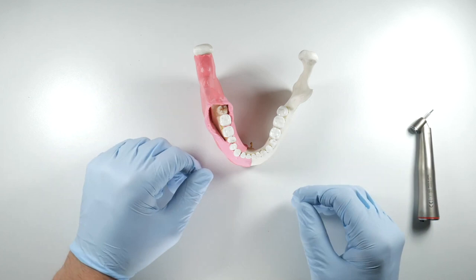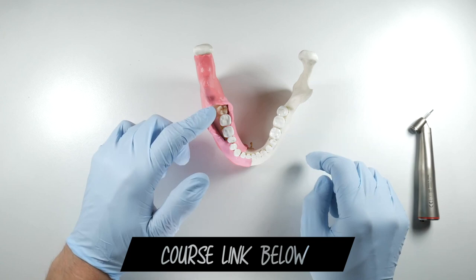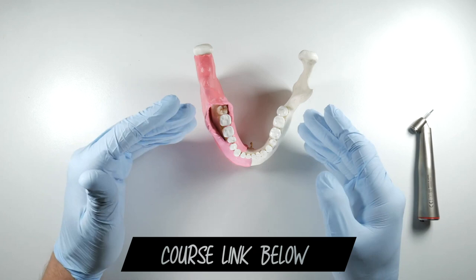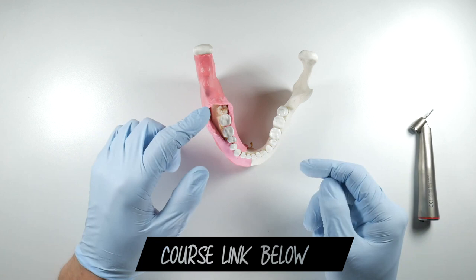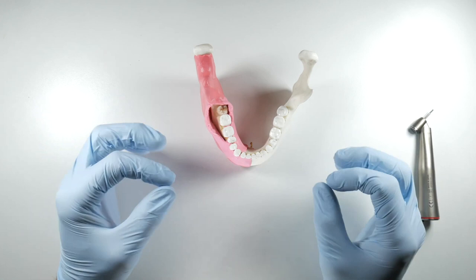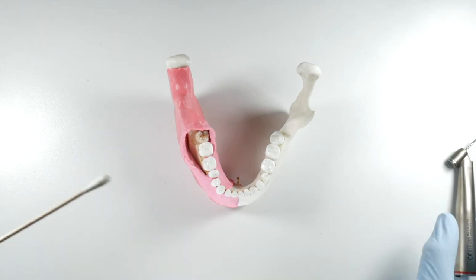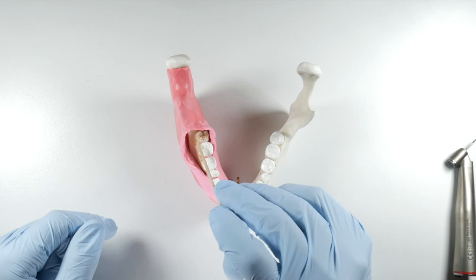Be conservative, but be deliberate. When doing bone removal back there, we want to keep some cortical bone. Our trough should go down alongside the tooth, but try to preserve some of this cortical bony collar. We want something very solid to place an elevator on and fulcrum off of. If you take a lot of cortical bone away and drop it way down beneath your purchase point, you'll have much less levering action and less ability to lift those teeth out. Also try to keep a bony collar behind the lower second molar — that cortical bone is very important for healing.